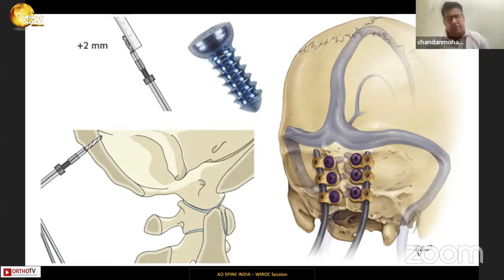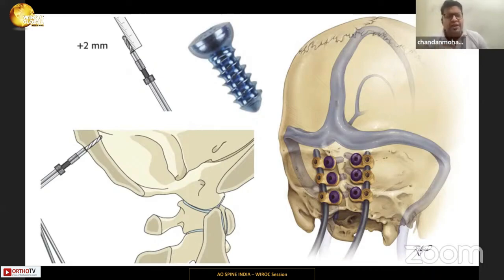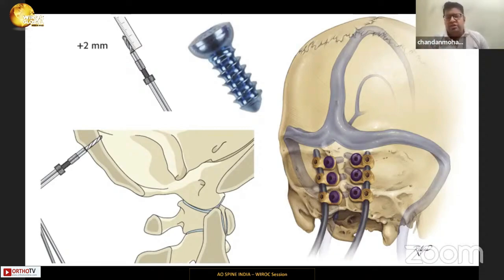The screw tip is usually very blunt. We start with a handheld drill beginning at 6 to 8 mm and then gradually increase by 2 mm until we achieve a bicortical trajectory.